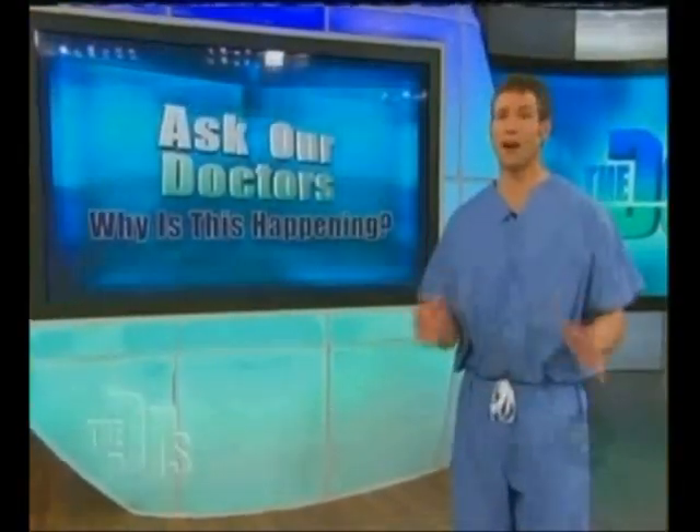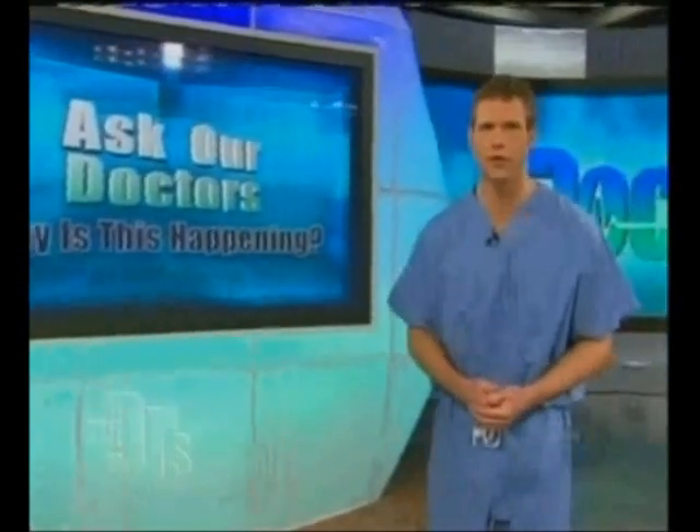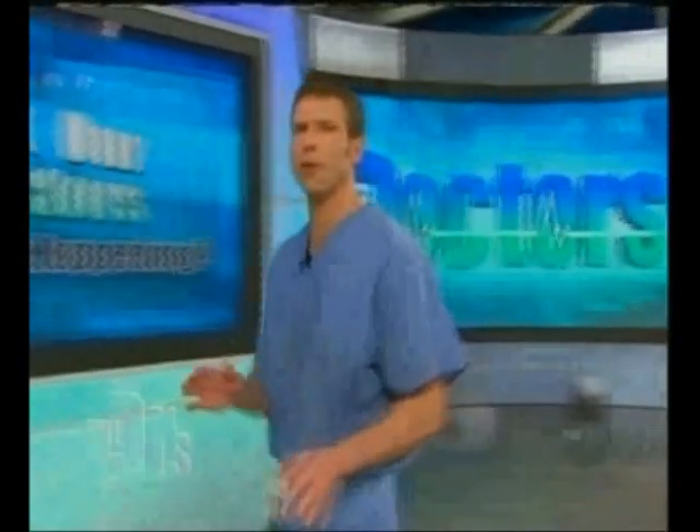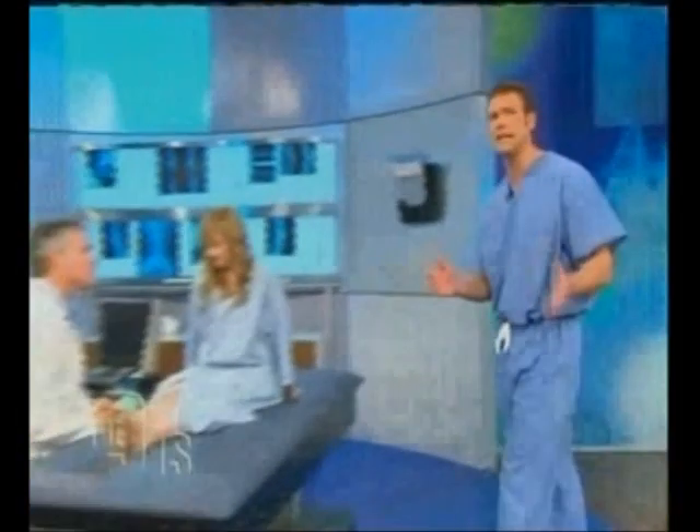Dead limb, or sleeping limb as it's often called, is very common. It's usually not a sign of something serious, just a result of a sleep position compressing a nerve. But I wanted to show Amanda why and how this can happen, so I invited Dr. Peter Grant to help us out and run what is called an EMG test.